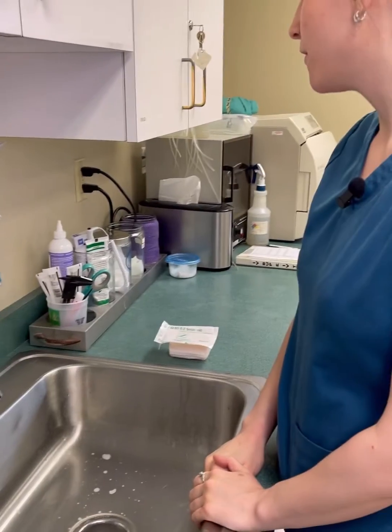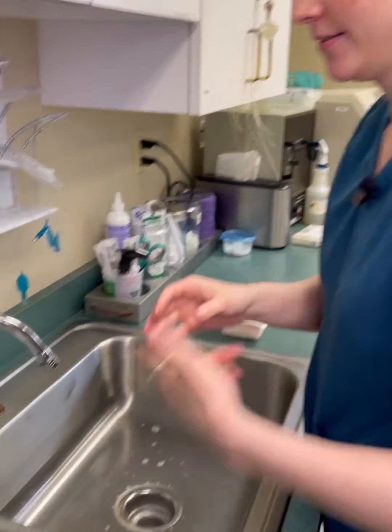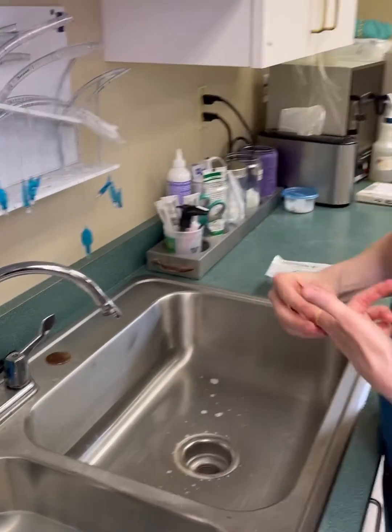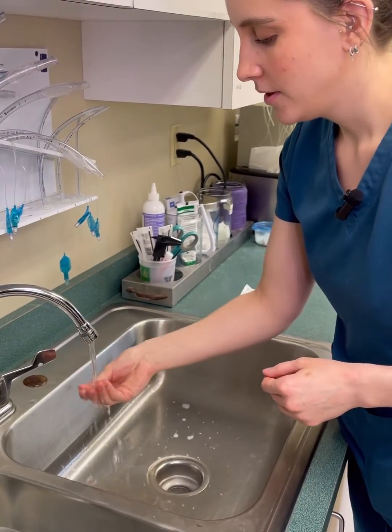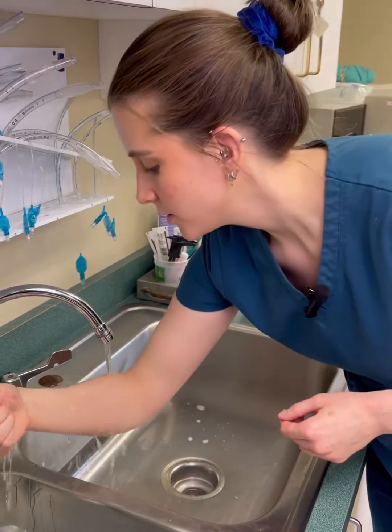I'm going to show you how to properly scrub for surgery. First, remove all of your jewelry and set that aside, then go ahead and turn on your water. Let both of your hands get wet, starting at your fingertips down to your elbows.